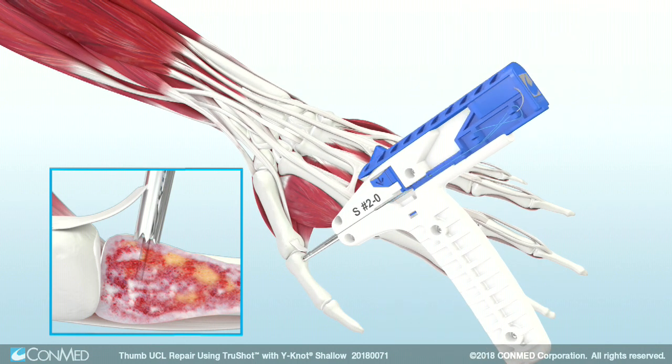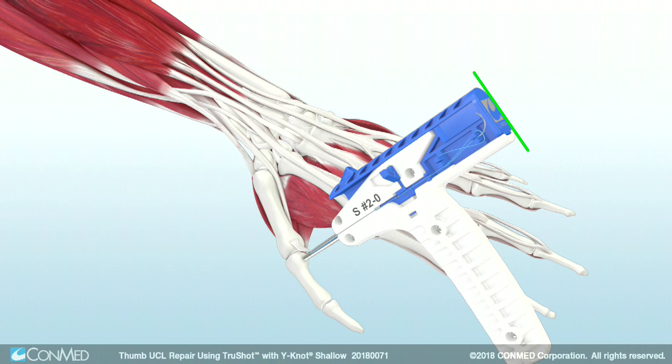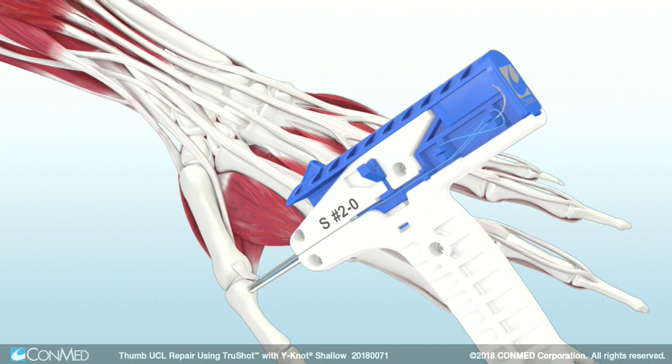Next, gently mallet the proximal end of TruShot to advance the Y-Knot Shallow All-Suture Anchor until the proximal end is flush with the white handle and the blue side trigger is fully extended. Notice that the arrow indicates pressure should be applied in a downward motion.